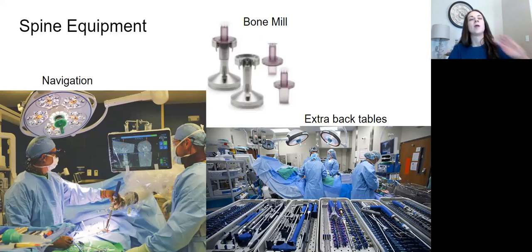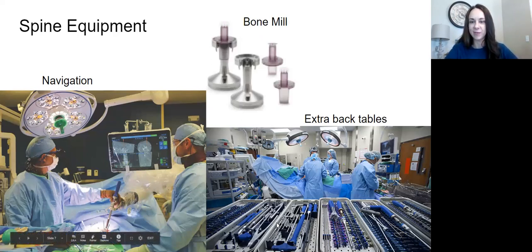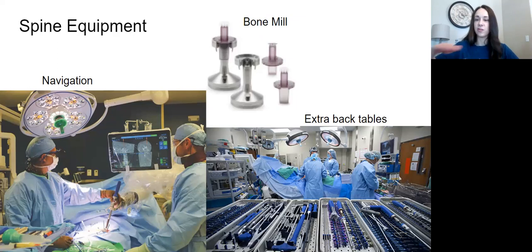Okay, so more spine equipment. You can see how many implants you're going to have on the back table. This is just some of the trays. There were many cases I did where we had a whole other table, besides this one, full of trays, or we would just start stacking and stacking and stacking until you get it. But that just means you're going to have to have extra back tables and more time to set up. Typically, stuff like this is a lot like orthopedics.